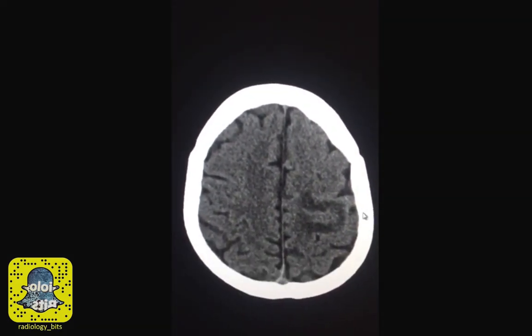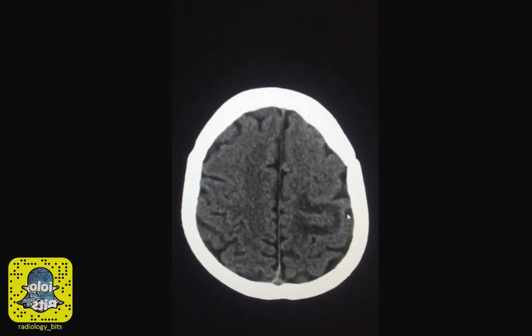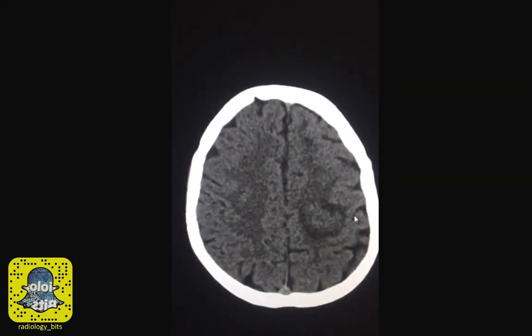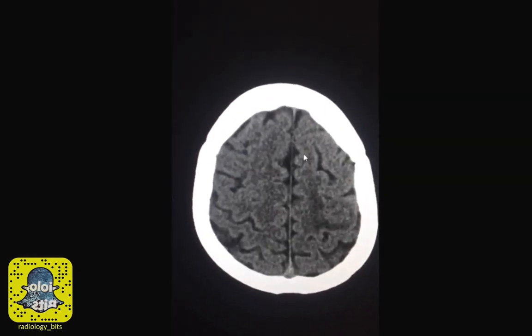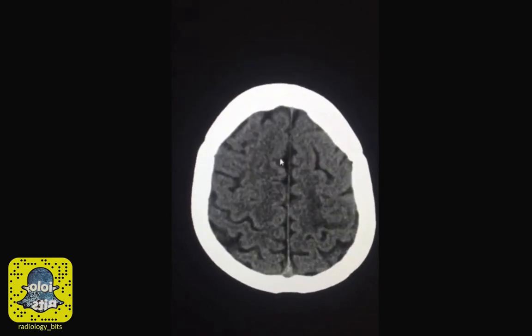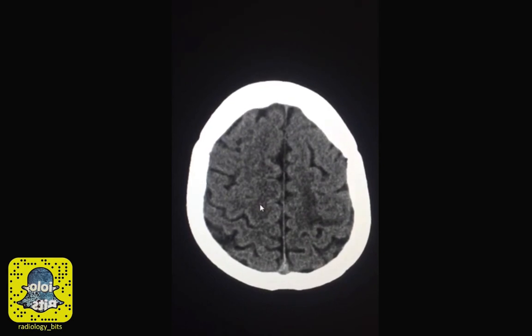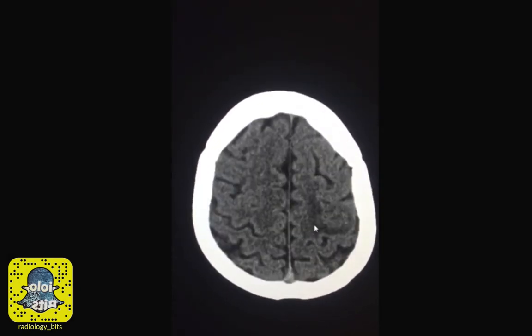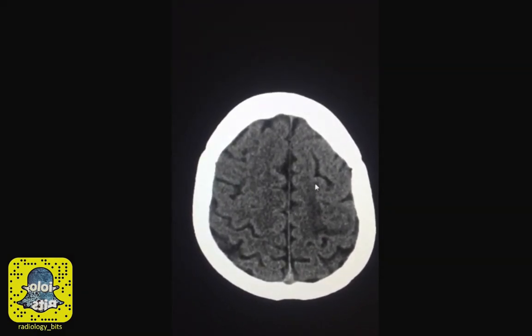edema? We discussed previously that cytotoxic edema is one of the things that are very commonly seen and is typically associated with infarcts, while vasogenic edema is typically associated with neoplasms, infections, and hemorrhage. We also discussed that on a normal CT scan, the cortex or gray matter appears white, while the white matter appears dark. That's normal. The main feature of cytotoxic edema is that you have cell death and you lose the cortex white matter differentiation.